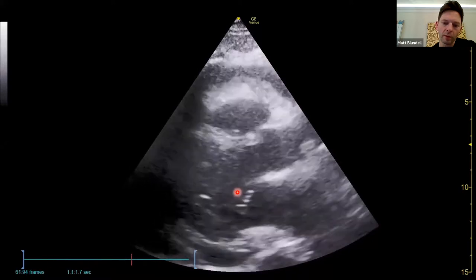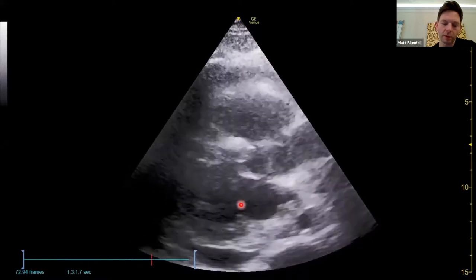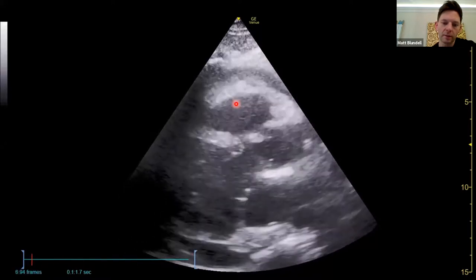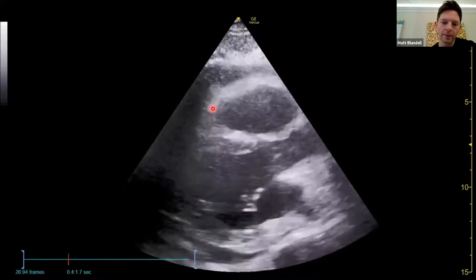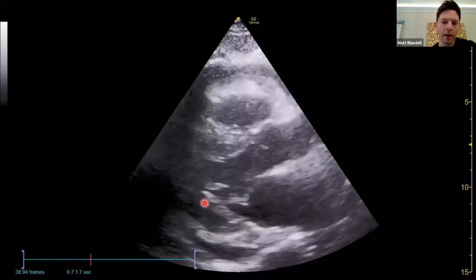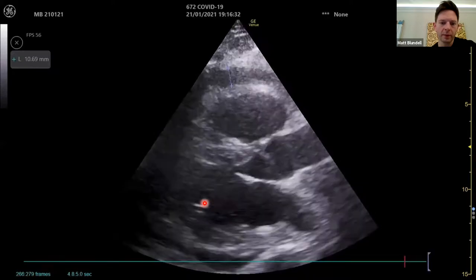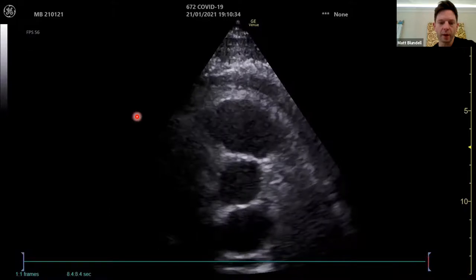And when the mitral valve opens, or the tricuspid valve opens, that corresponds to ventricular diastole. So this is termed diastolic collapse of the right ventricle, and that's the kind of sign of tamponade. They've started to measure it, so it's filing through, you can find the biggest area to measure. On the parasternal long axis, it's just over a centimeter, which equates to a moderate-sized pericardial effusion. Just confirms the effusion.